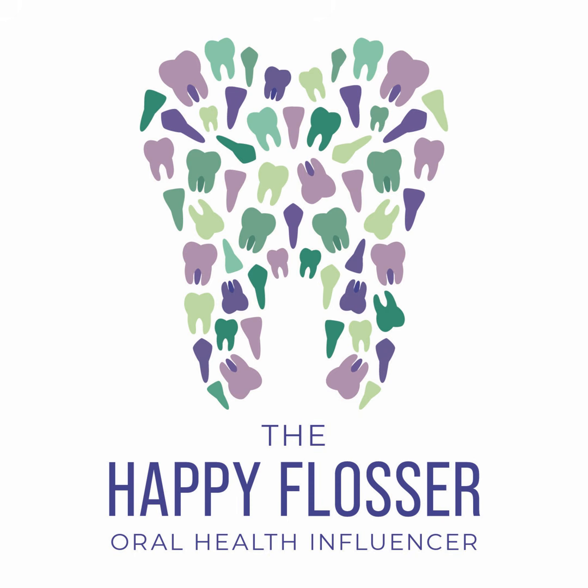The restricted opening is an additional challenge. How are you going to get that sensor in place when your patient has a really restricted opening? Some patients are tongue-tied, so there's a lot of limitations as far as the space allowed to take the image on those lower anteriors. These are just some of the examples of the challenges that you will face as far as anatomy goes.